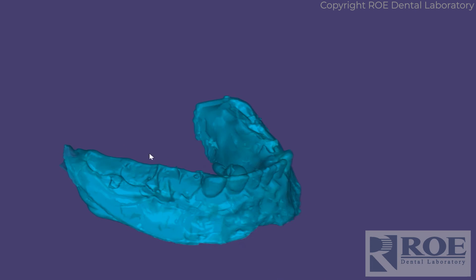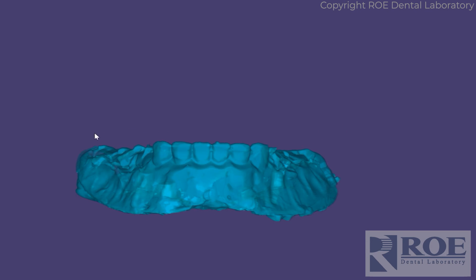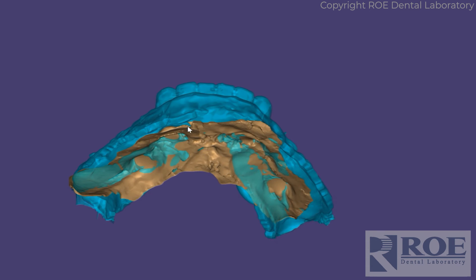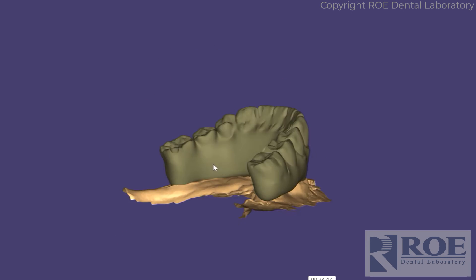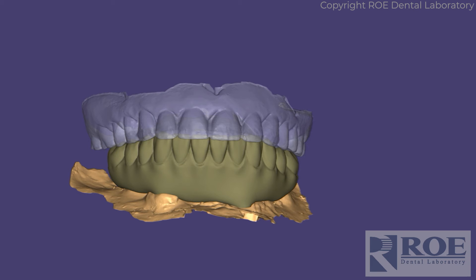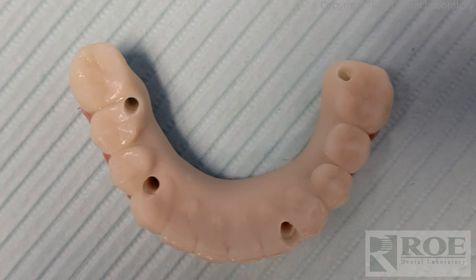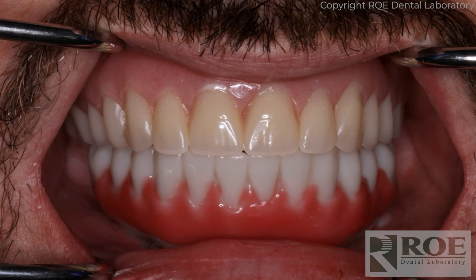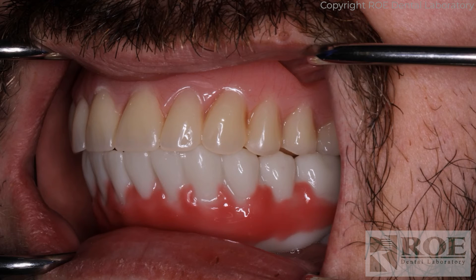I know that if you were to study this, you could pick this case apart — the bite, the overjet, that kind of thing. But the doctor was very comfortable with the bite, and from that bite we designed the tissue and the prosthetic to fit the opposing. We sent this file to the doctor, the doctor printed it overnight, added some pink to it, and delivered the next day. Don't judge the colors — the patient smiled. It was very efficient, very accurate. The doctor was thrilled with it; there was no adjustment. The patient left the next day with some loaded teeth.